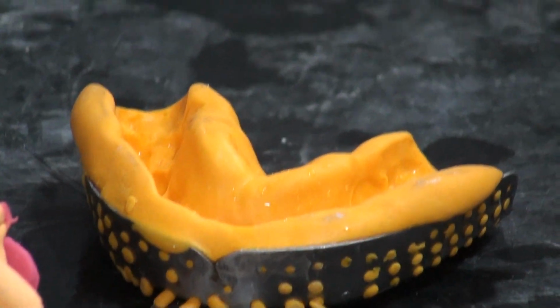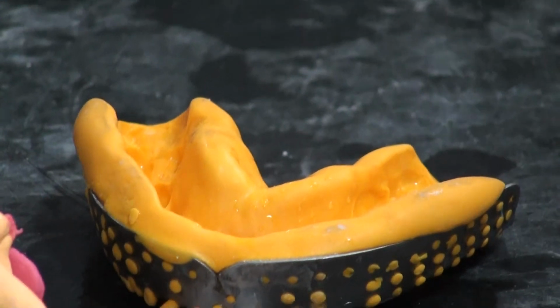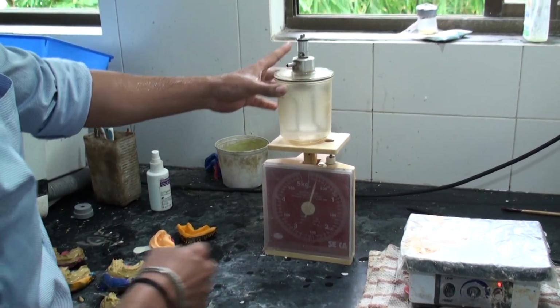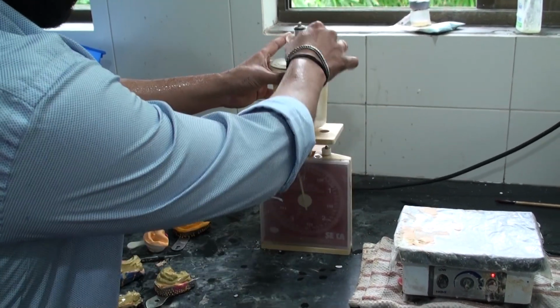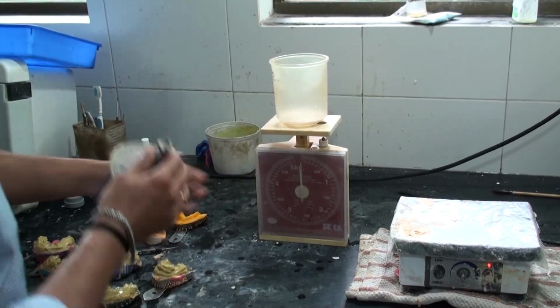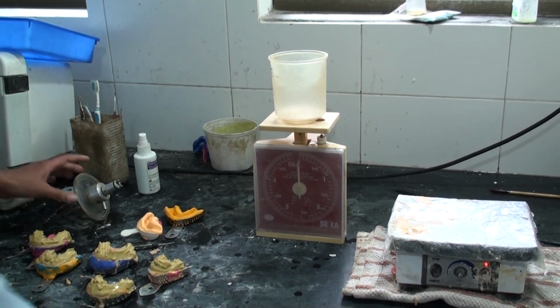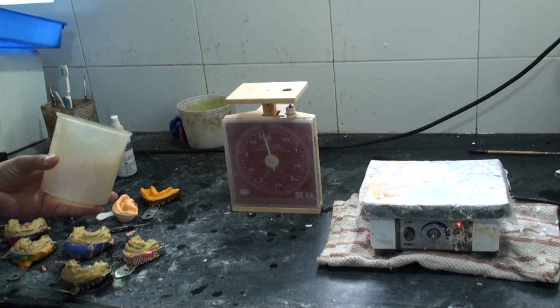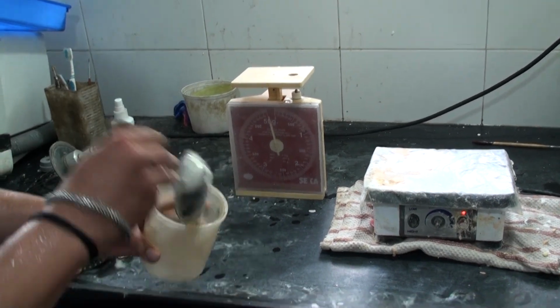Evaluation of the impression. Check if all the areas have been covered. Check if there are any air bubbles. Once it's been passed, then we start mixing the stone plaster. We set it on the platform on the weighing scale so that we get an accurate amount of stone plaster powder and the water to go in it.